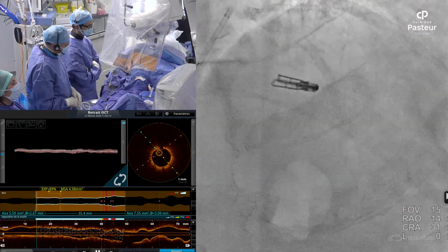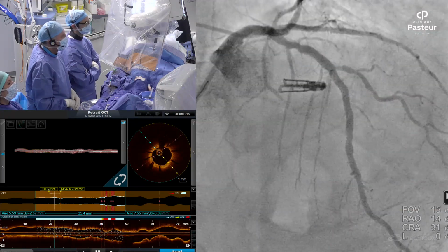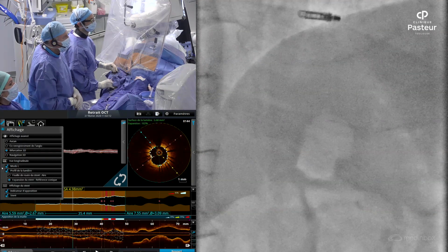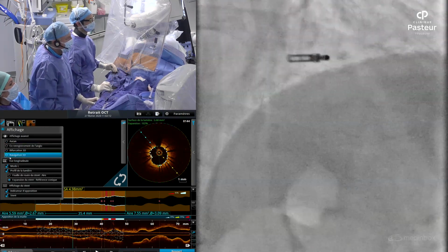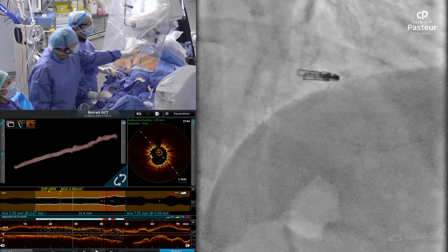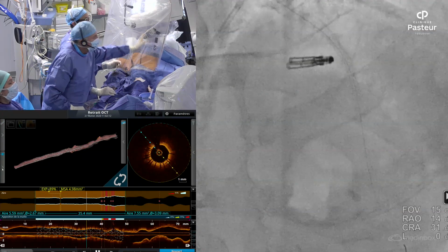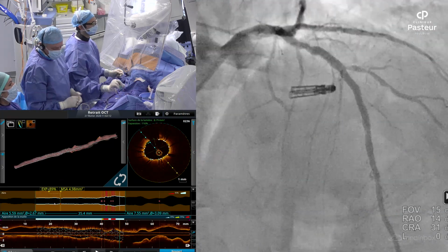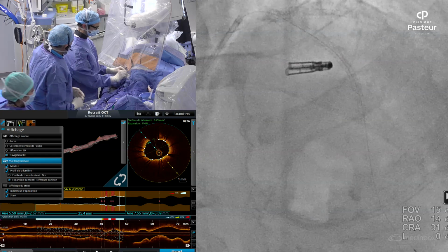I completely agree. I think you have to decide your strategy very much on the patient's individual situation rather than just have a blanket approach. And you're never going to put an elderly patient through major surgery when you can fix it percutaneously. Yes. So we are perfectly on time. Okay. I don't know if you have other questions to address to Bruno and Benjamin before we close.